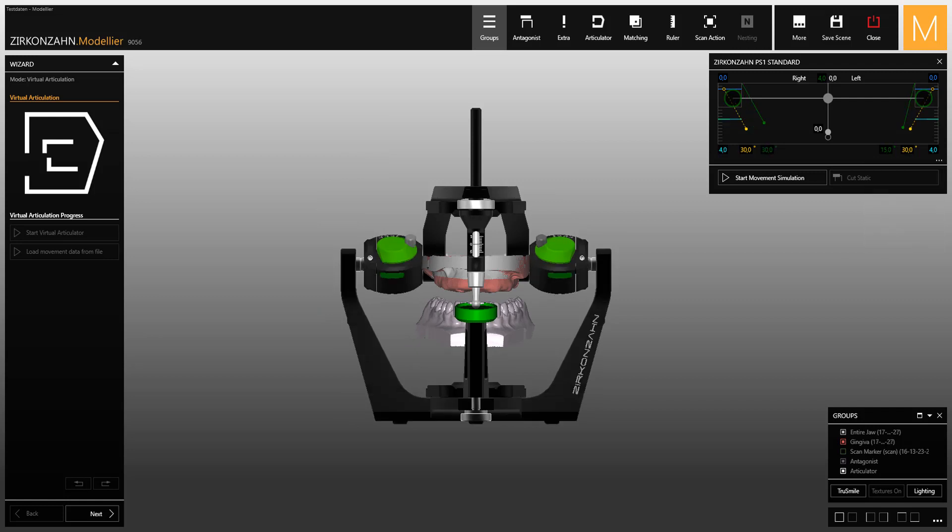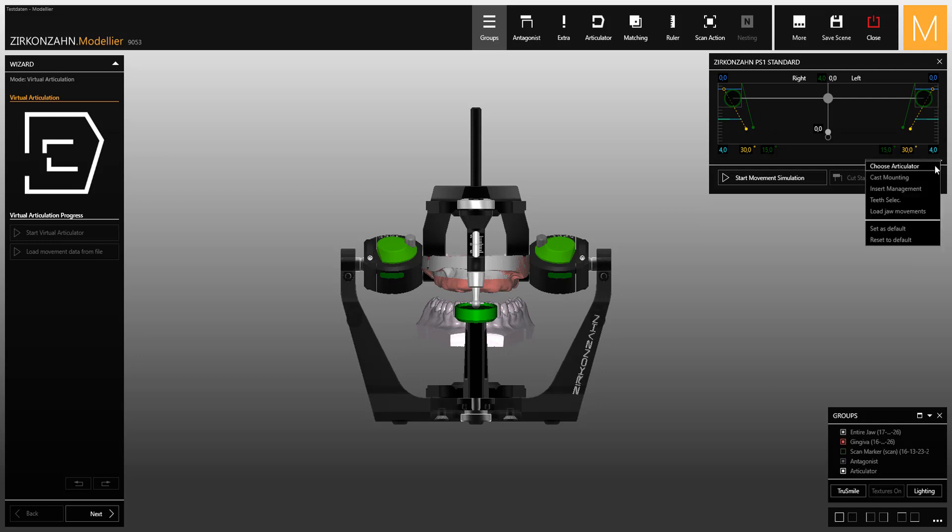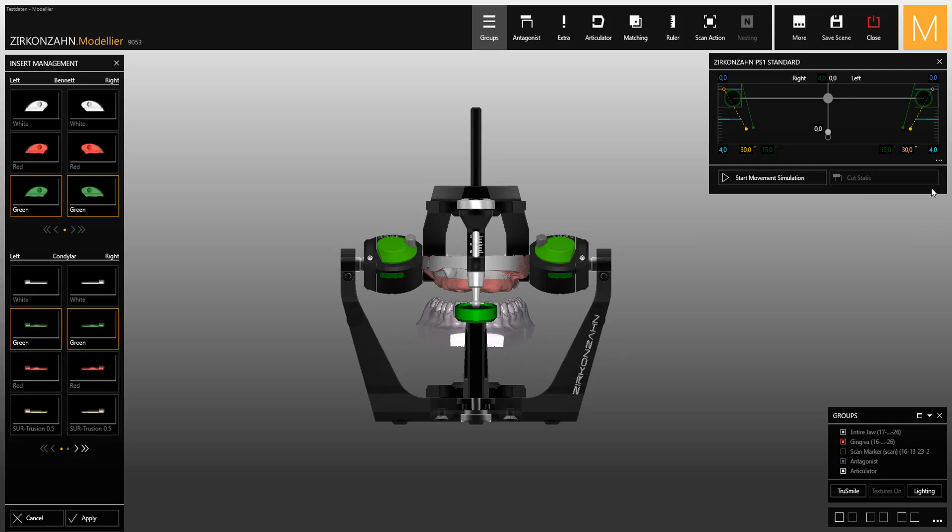In this window, you can find some more options like the insert management function, which allows you to change the articulator inserts.